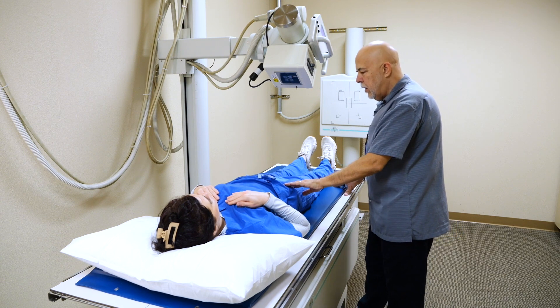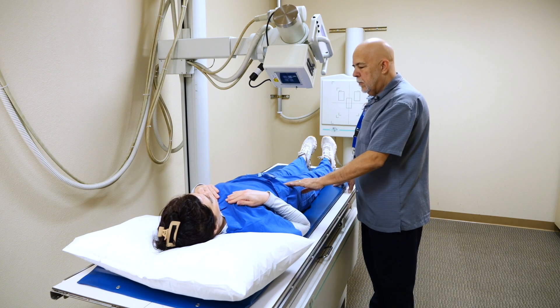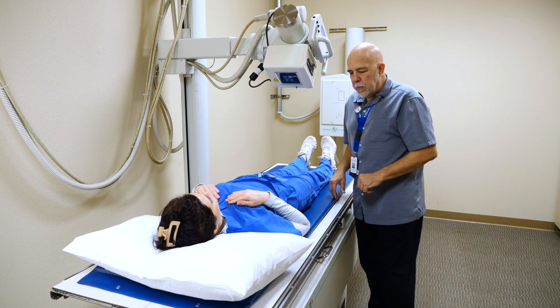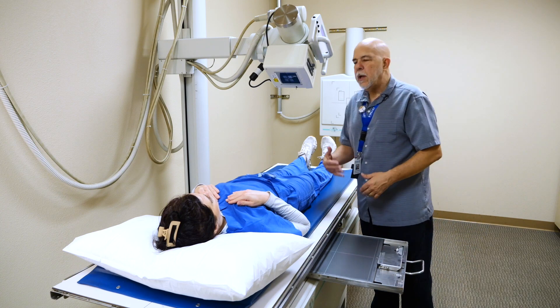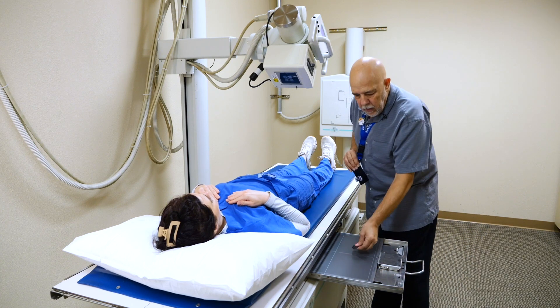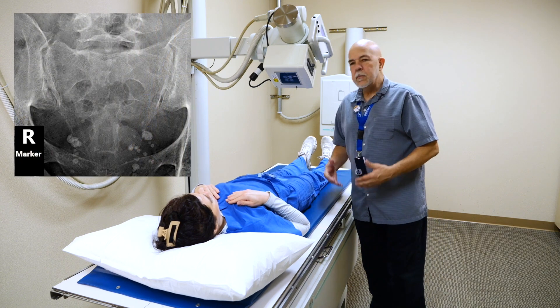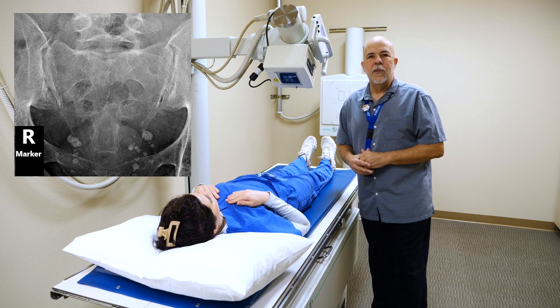We're right on there. You can put your marker on the left or right side — either one. It's easier for me on this one to do the right side. Just put it laterally to where your image is going to be and shoot the image. That is the AP.